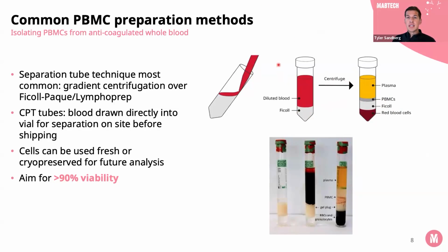This is what we're mainly using in-house at Mabtech. You do have to be quite skilled to do this. You don't want to just let anyone in the lab go and do this right at the beginning of a clinical trial. You want to make sure that people are well practiced and rehearsed in doing these.